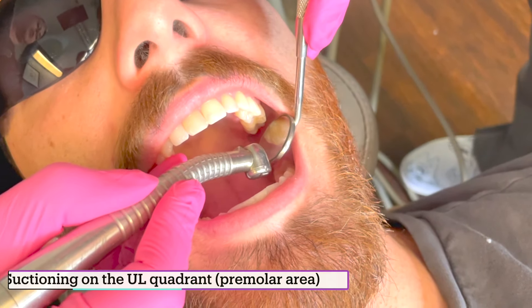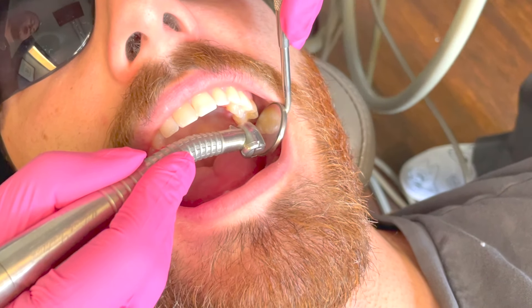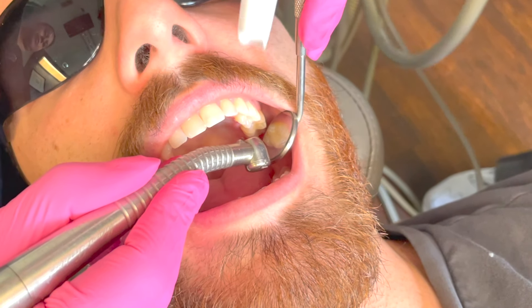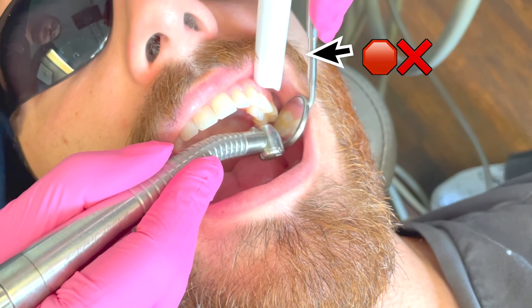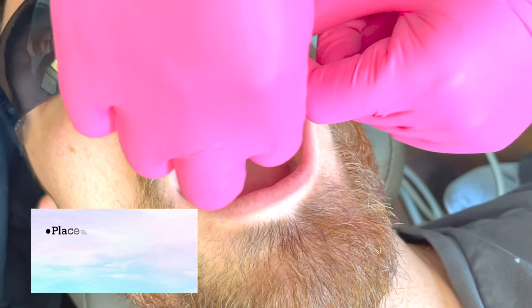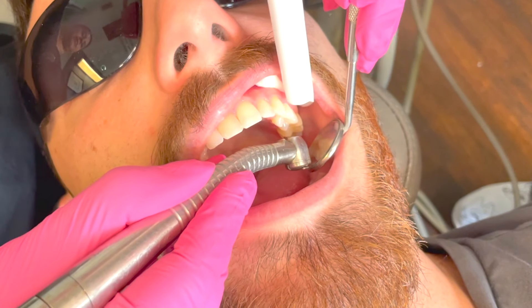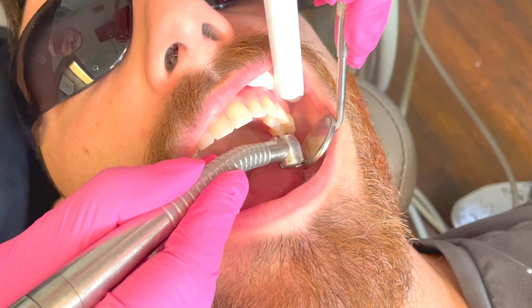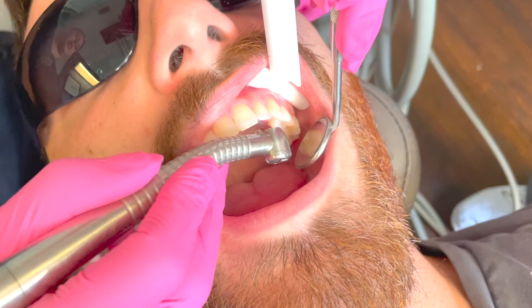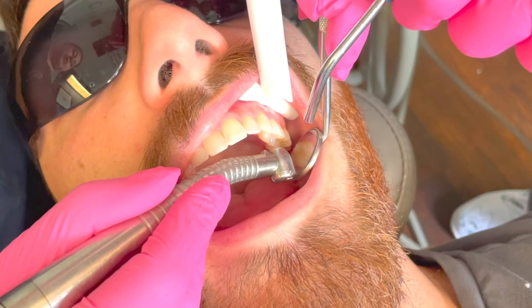Now we're moving to the upper left — let's say we're working on number 12. We have the mirror there, so we need to keep it clean and dry for the doctor. If you don't have anything retracting, you're just going to start suctioning the cheek. Before the doctor positions, I'm going to put a cotton roll right there and rest my suction on that cotton roll, so I'm not suctioning the cheek or lips, and not resting directly on that fold — because that hurts. Then the mirror is going to need some air, and you're suctioning right there.